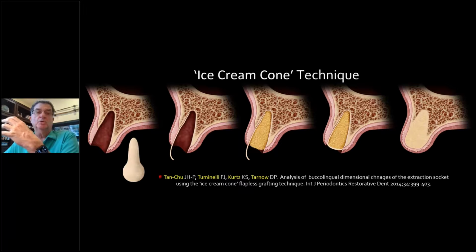So you put the cone part inside the socket, and you trim the top part to fill the top part of the socket, like you see here. This is old stuff. We place the graft in, and then flip it over. Now this is where all the work is getting done, right in here, because that's going to block this fibrous tissue from penetrating into the graft. This top part that's exposed will disappear within 2 weeks.